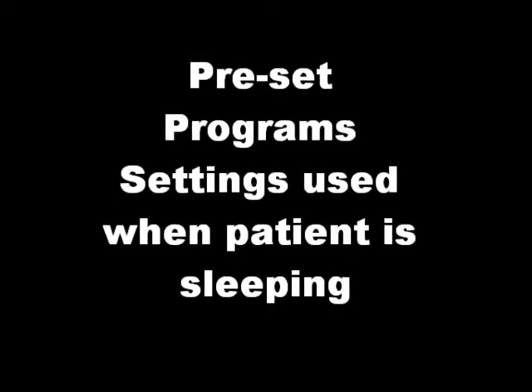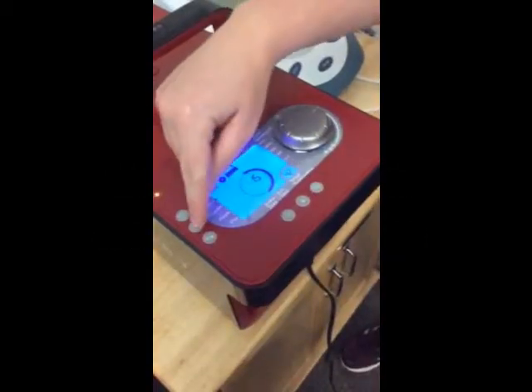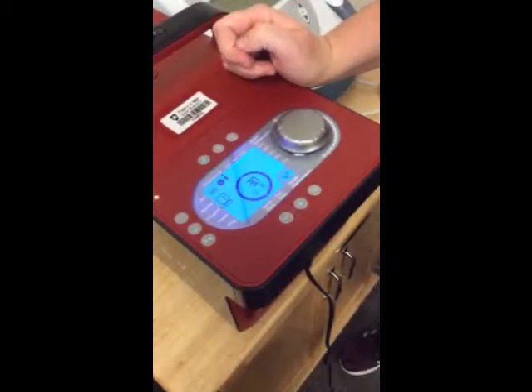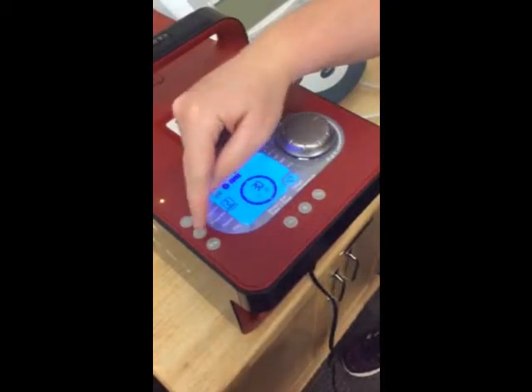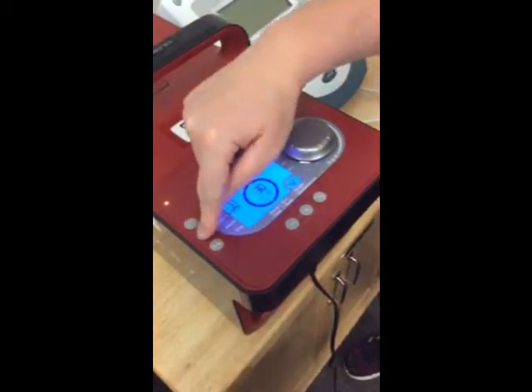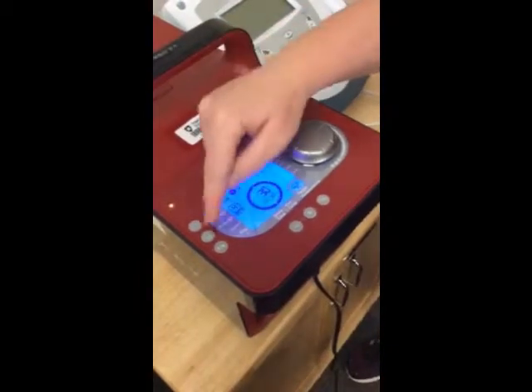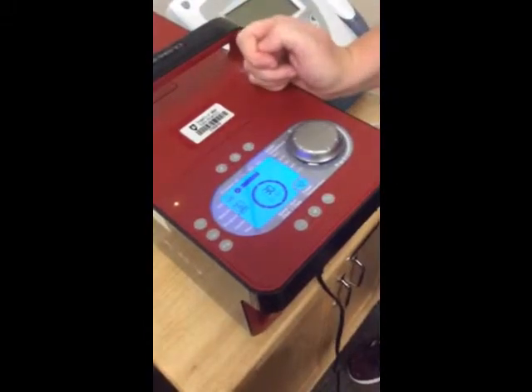These different preset programs are often used when a patient is sleeping and have longer on-off times. Programs 1 through 3 provide treatment for 30 minutes and sleep for 30 minutes at no pressure, low pressure, or medium pressure respectively, while programs 4 through 6 provide treatment for 30 minutes and sleep for 60 minutes at no pressure, low pressure, or medium pressure respectively.